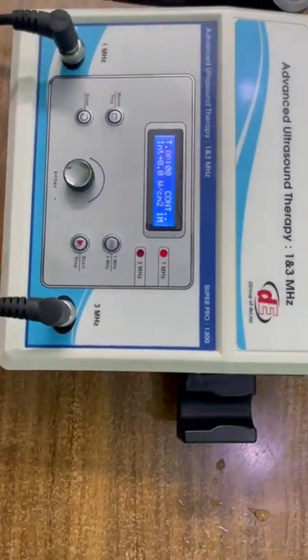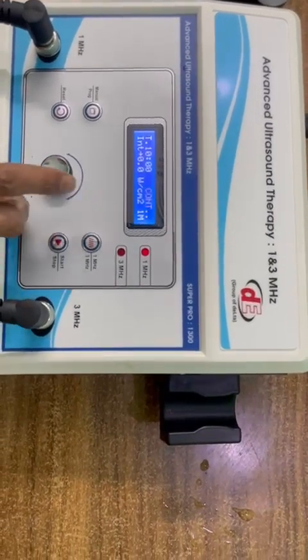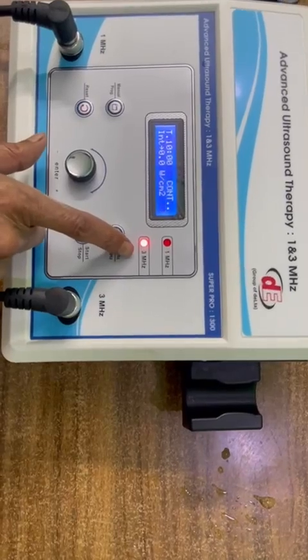Set the time, like 10 minutes. Continuous mode blinking, okay, continue. Now we can set it 3 MHz.